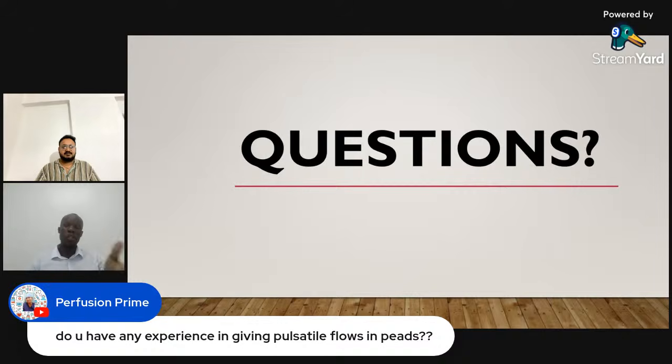I've never done that, though some people say pulsatile flow, mostly in adults, is good because it increases perfusion to the organs compared to non-pulsatile flow. It mimics natural circulation. But for us, we don't. I've never encountered the use of pulsatile flow.